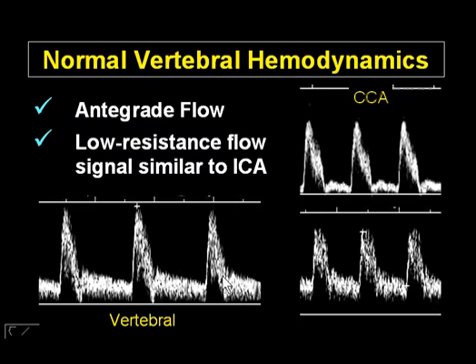This is a typical vertebral artery waveform. It will somewhat mimic, or be a combination really of, the common and the internal carotid arteries. It should be low resistance because it feeds the brain directly through the basilar artery where both vertebrals come together. So really you should be seeing a sharp upstroke, which again you should see in all vessels within the carotid system in the absence of significant proximal disease, but lots of diastolic flow.